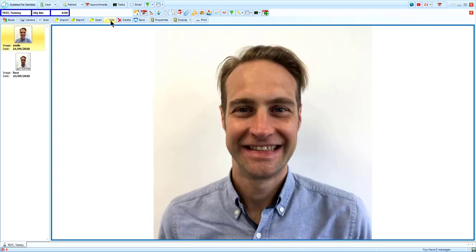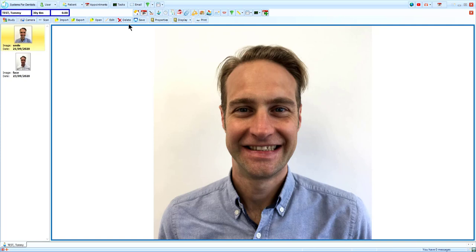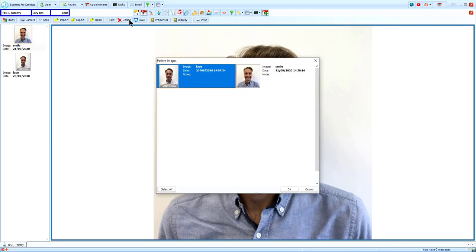I will cover all of the functions available from Edit in another video. From Delete, select an image you want to remove and click OK to get rid of it.